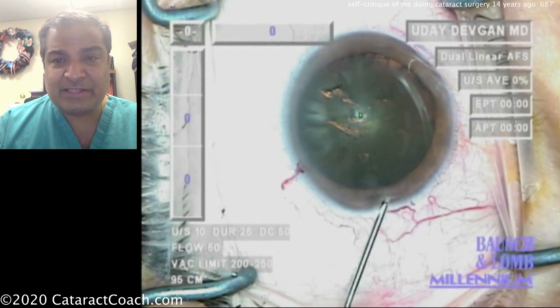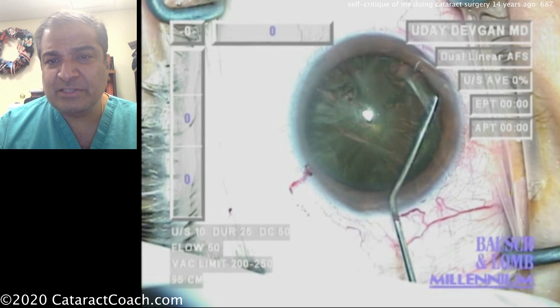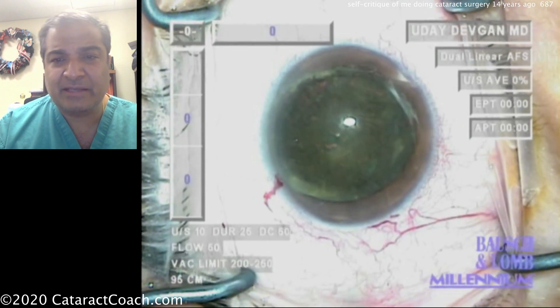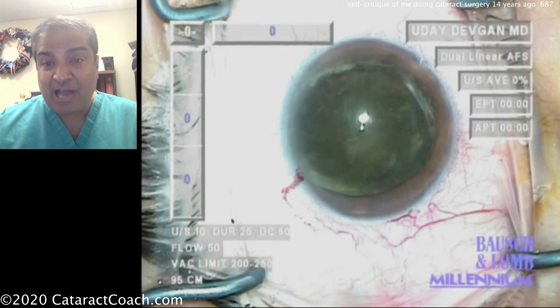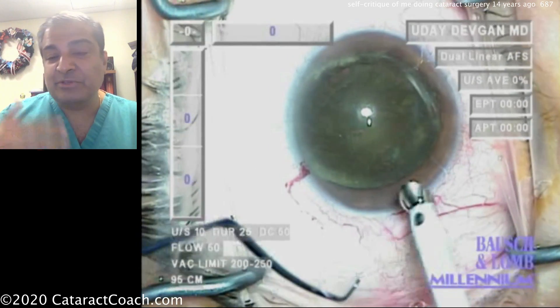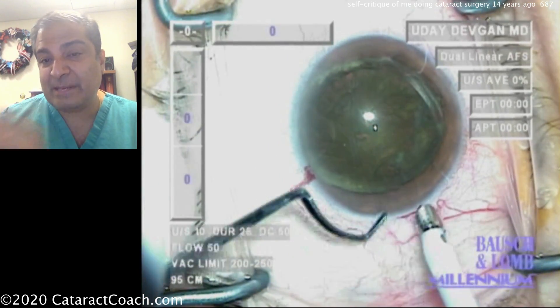Here's the hydrodissection, which is going to be pretty typical. And this nucleus with moderate nuclear density is prolapsed partially out of the capsule bag. Normally now I'd recoat the endothelium with viscoelastic to protect it, but you'll see in this video we don't do that — so that's a step that could be improved.